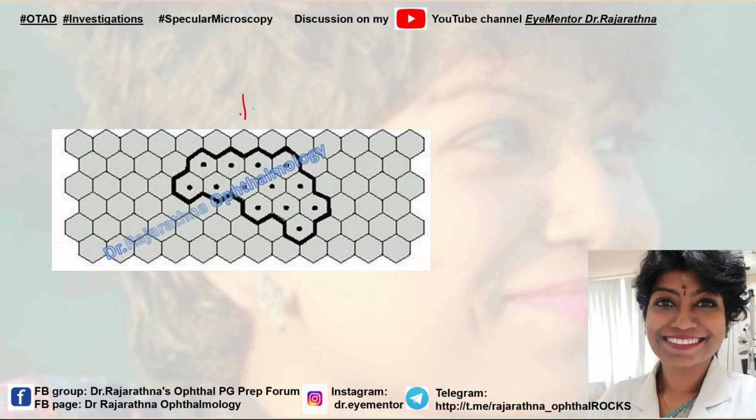So take a look at this one. Here, using the software, but manually, we are outlining complete cells. So I can choose to have different frames, right? So maybe I can choose something here. So variable frame. So I don't have that single one frame; depending on the size of the cell, accordingly the number of cells would come in there. So this would have been a fixed frame, whereas this is a variable frame. Now what is this single field and multiple field?